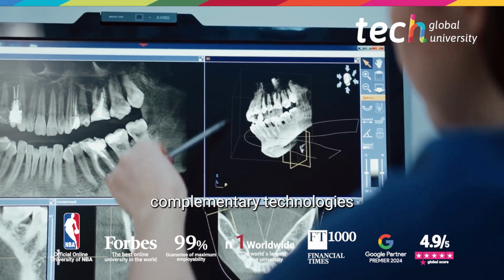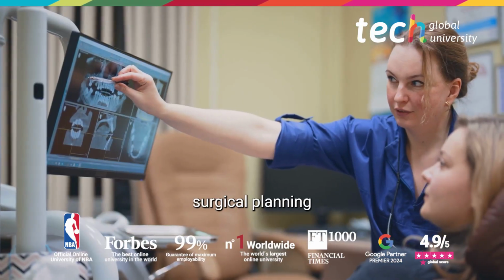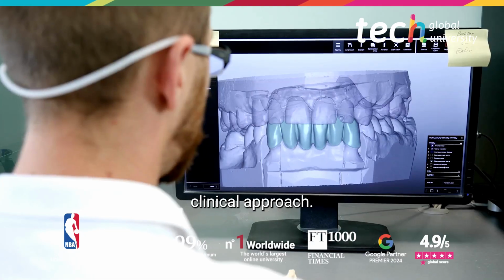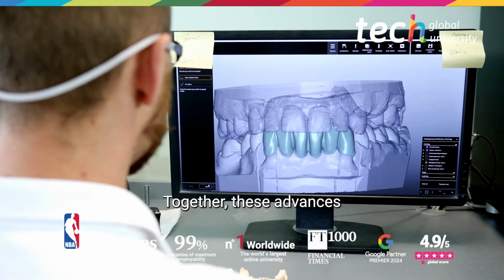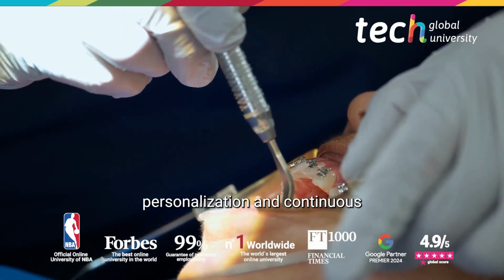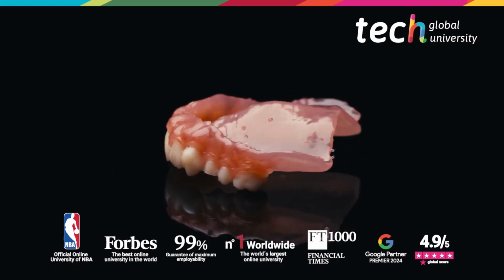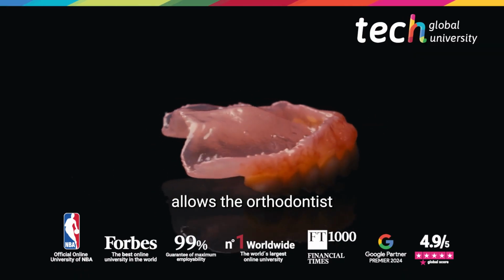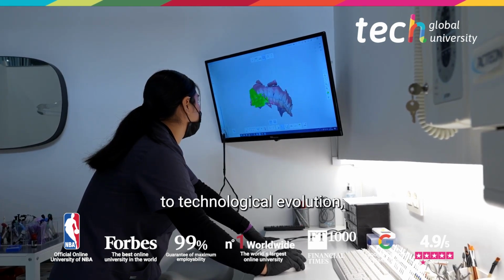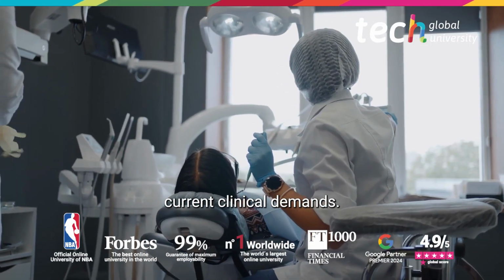Their integration with complementary technologies such as 3D radiology or guided surgical planning enables a more comprehensive and coordinated clinical approach. Together, these advances consolidate a new paradigm in orthodontics, characterized by precision, personalization, and continuous improvement of care quality. The implementation of digital models allows the orthodontist to base each decision on objective data, adapt to technological evolution, and respond more effectively to current clinical demands.